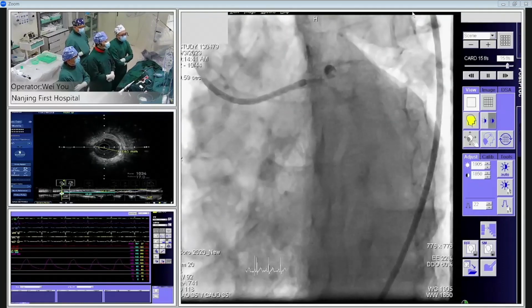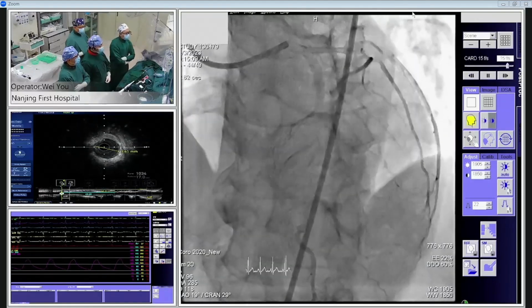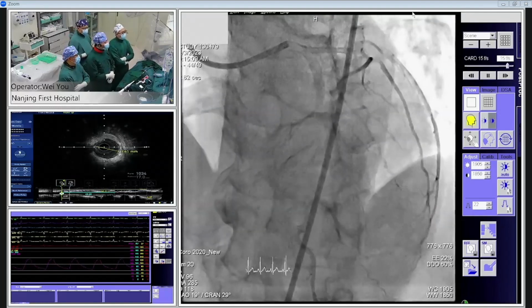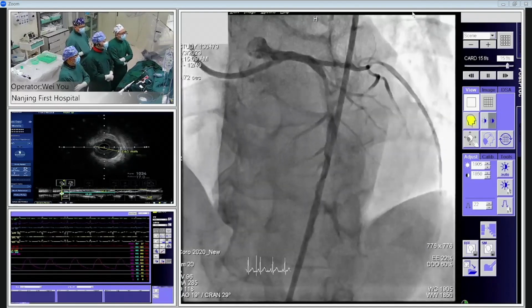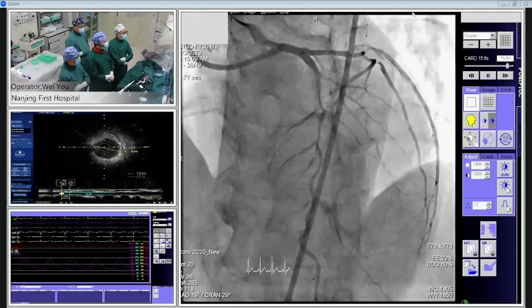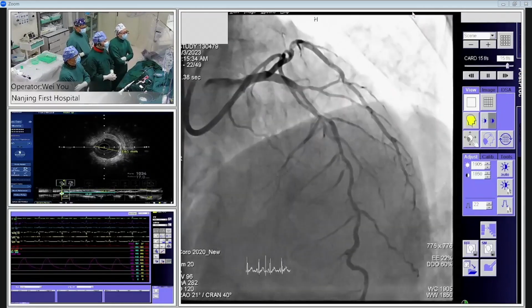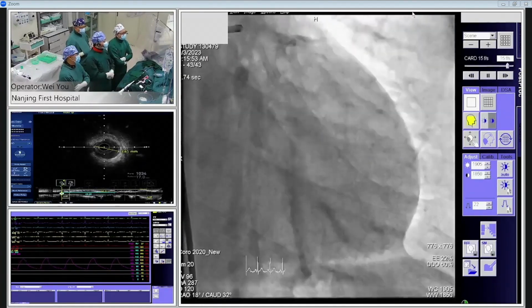But today our target lesion, please switch to the cranial view. It's LAO cranial view very clearly. It's diffuse long lesion just involved from the proximal LAD extended to the distal LAD. And the proximal segment of LAD, you can see very severe, heavy calcified lesion, and also with the angulation more than 45 degrees. Next, please. Okay, this is our today's angiography.